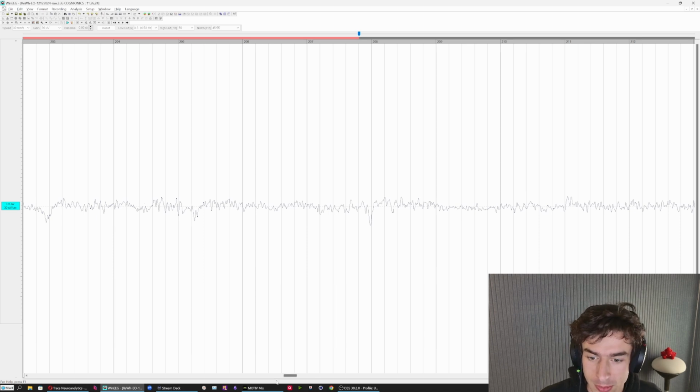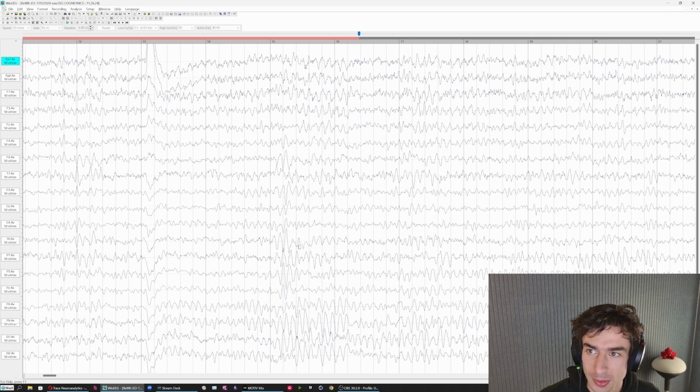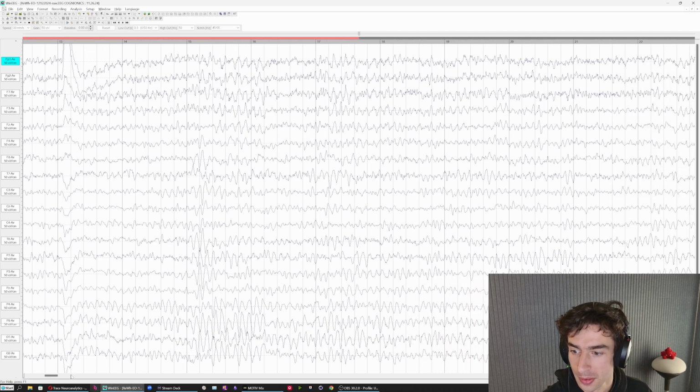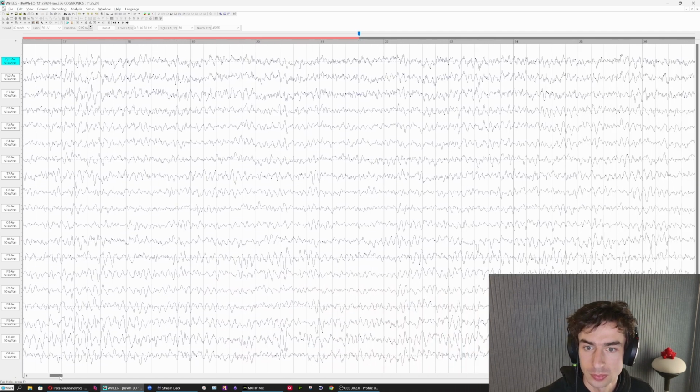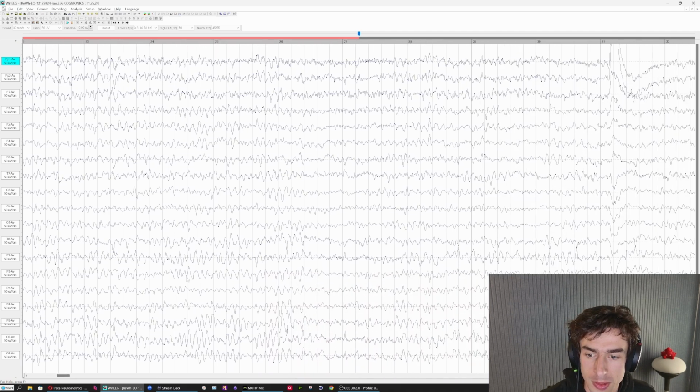Oh, and for some reason, we're already halfway through this record. So let's go back to the beginning. We're going to scroll through and see what we see. So we see some alpha activity at the back of the head here, and to a certain extent, it is projecting forwards.